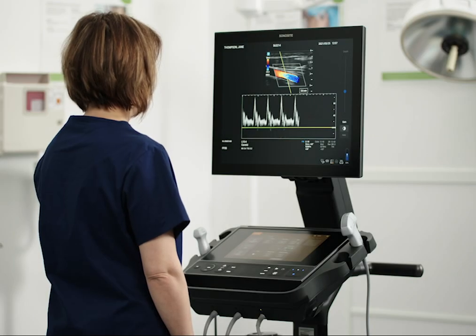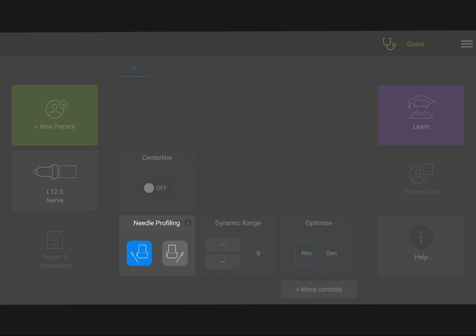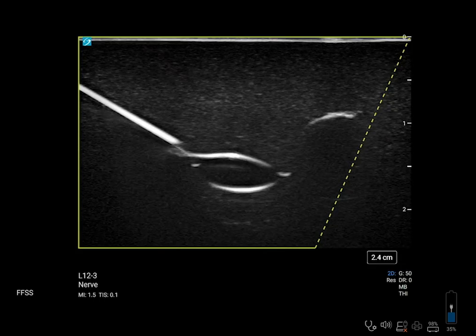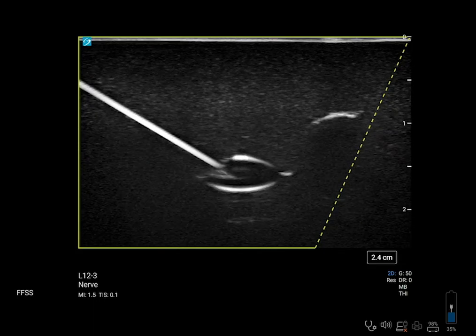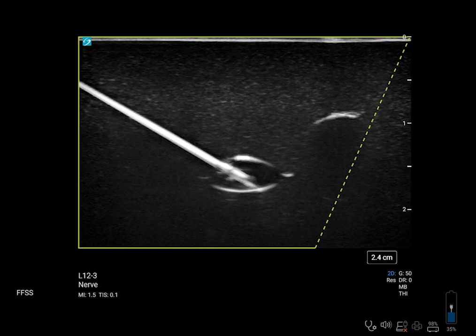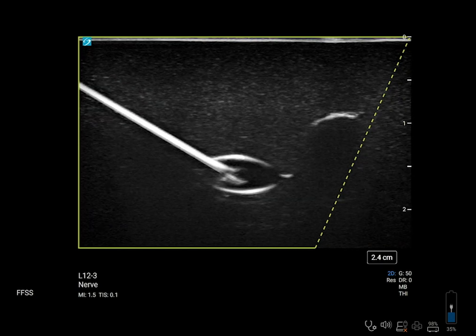If you are performing a needle procedure, take a look at needle profiling. Needle profiling can help visualize the needle during these procedures. You will still need to use movement and fluid injection to locate the needle tip.